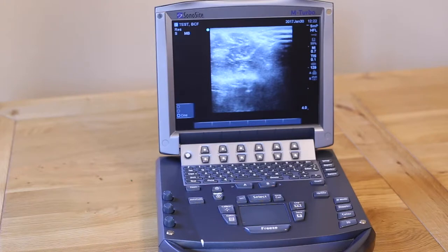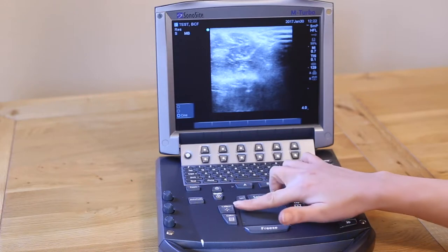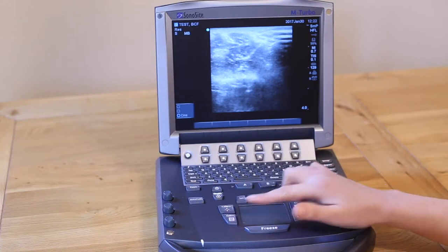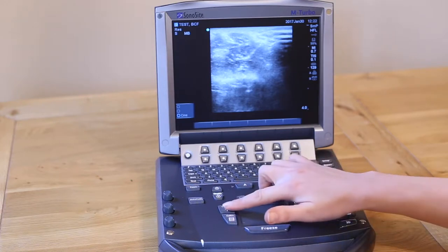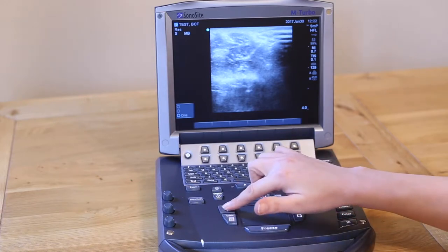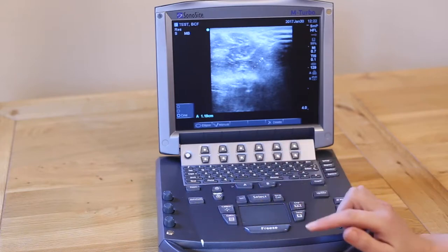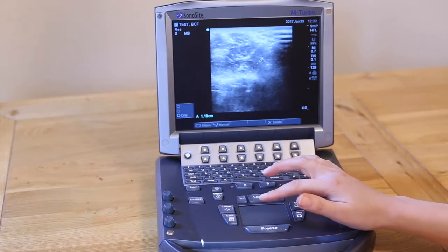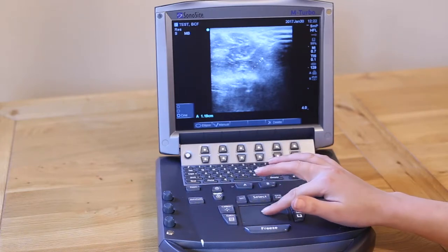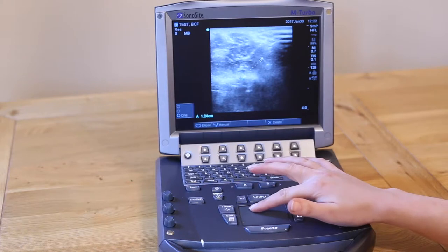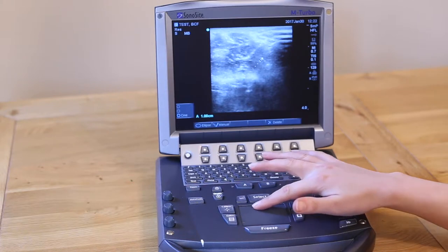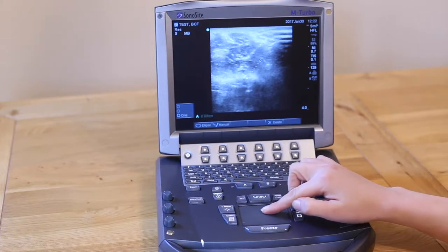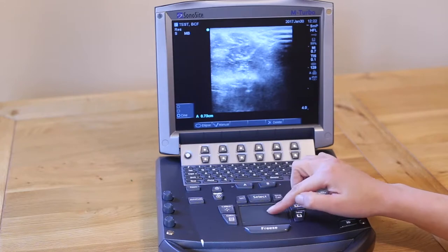To make a measurement, either press Caliper or Calcs, located to the left of the trackpad. For calipers, a set of calipers will appear on the screen. By moving your finger over the trackpad and pressing Select, you can change the location of each caliper in turn.